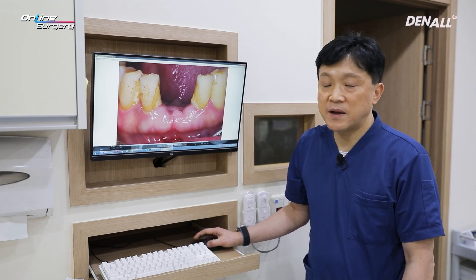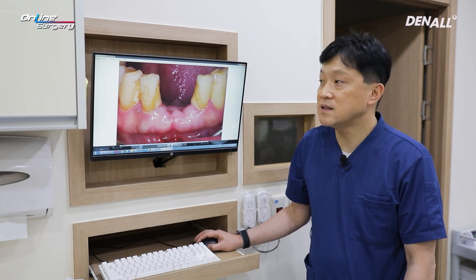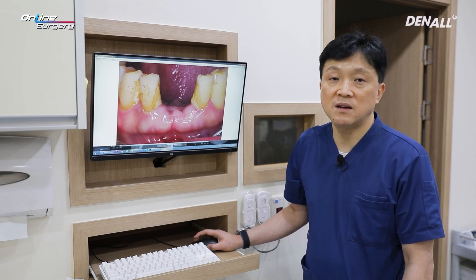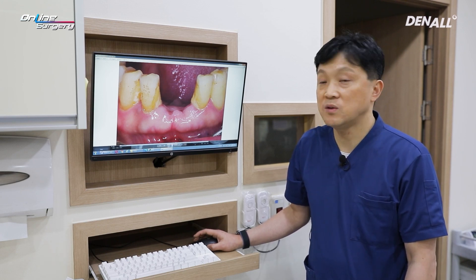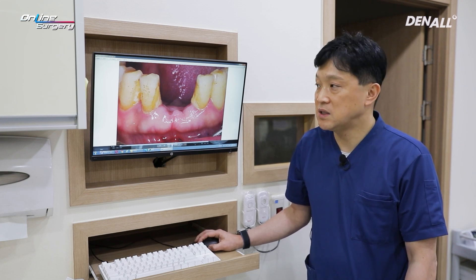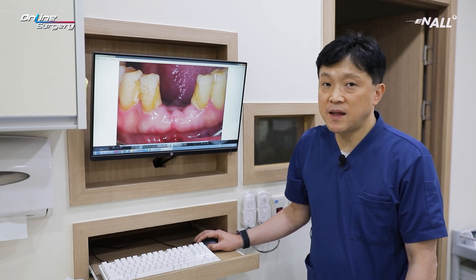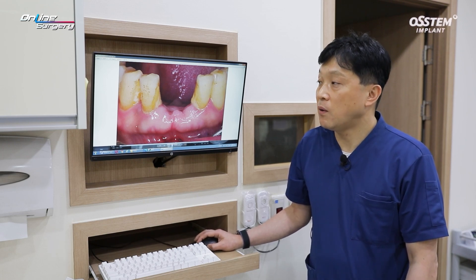When you do immediate implant placement, you need to consider remodeling that occurs after treatment and gingival recession. Therefore, you need to place the implant about 1 to 1.5 mm deeper in order to prevent aesthetic issues. In order to compensate for gingival recession or remodeling of alveolar bone, we not only need to place the implants correctly, but we need to also address the extraction socket today.